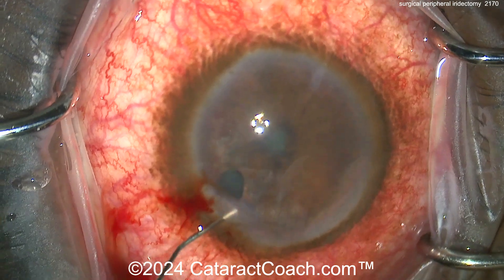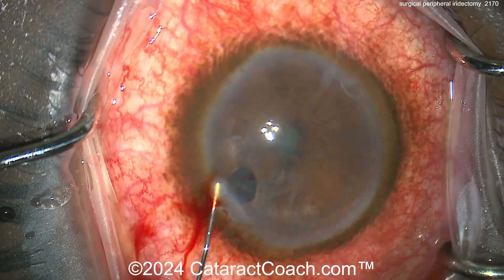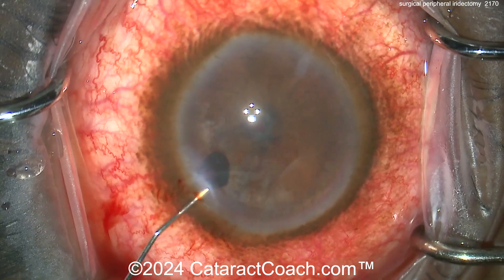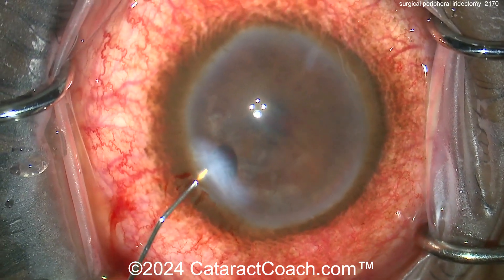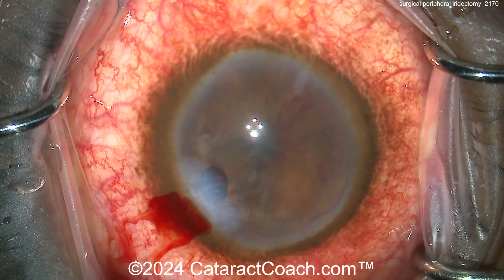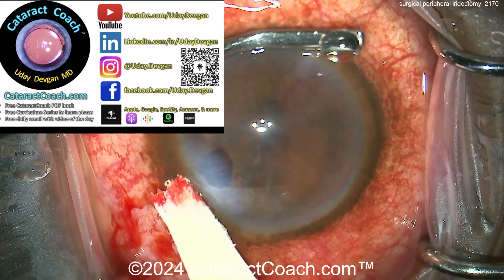Now seal up the incision — make sure you really seal that incision, and that's why you want to have a longer tunnel length. The bleeding is because again it's a very hot, angry, inflamed eye and the patient had to have this procedure done to resolve the acute glaucoma attack. Here's hydrating up the incision — make sure it's absolutely watertight. And now you know how to do a surgical peripheral iridectomy with scissors.